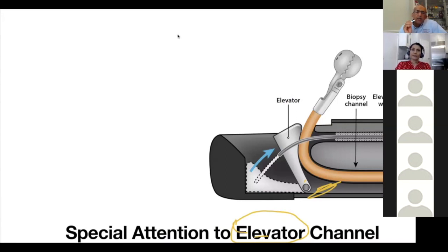And those two problems we could not have managed if somebody did not devise the elevator channel. So that has completely changed the role of endoscopy, expanding it into pancreatic and biliary disease management.